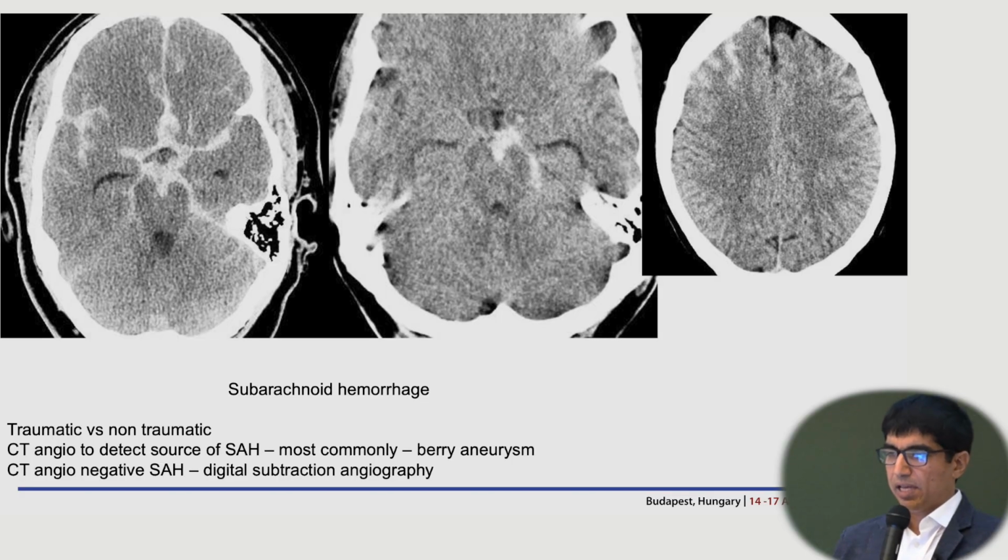However, the other aneurysms like ACOM and distal anterior cerebral artery aneurysms are less notorious, and they can be picked up very easily. Interhemispheric bleed or a gyrus rectus hematoma typically indicates an ACOM artery aneurysm, while a corpus callosum hematoma or a hematoma which goes along the territory of the distal anterior cerebral artery would be a DACA aneurysm.